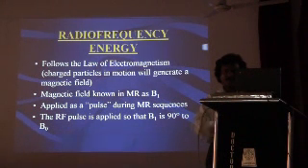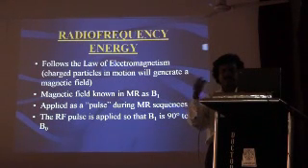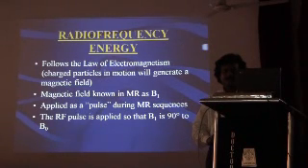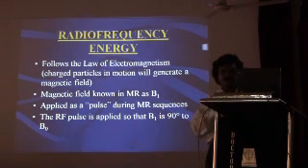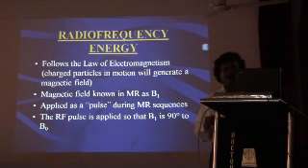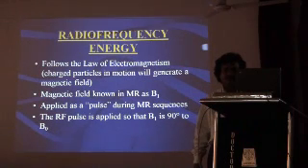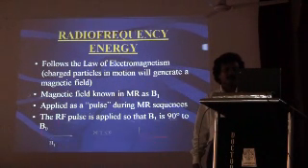Okay. We use a lot of protocols. In CT we use hardly 2 or 3 such protocols, but in MR we use a lot of protocols. In fact, this is very difficult even for an application specialist who deals with the MR machine. He doesn't know all the protocols. Every day 1 or 2 new protocols are erupting.